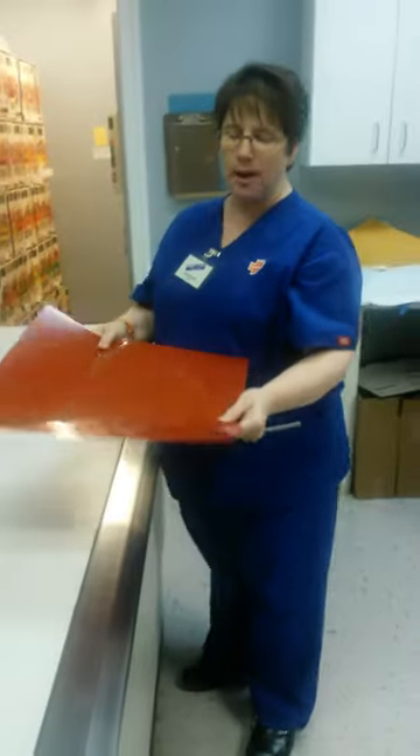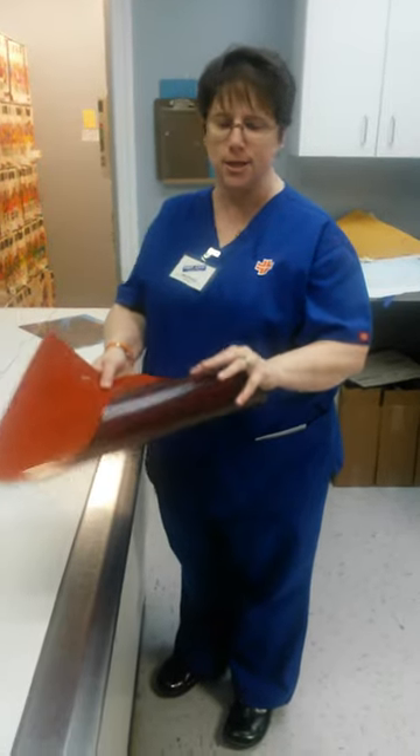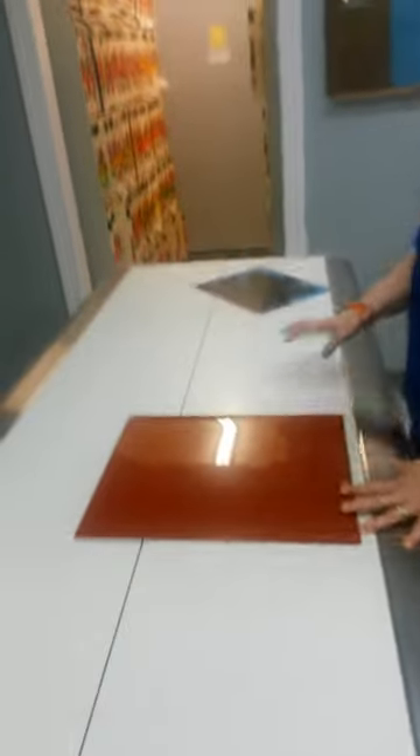This copy film has a light side and a dark side. If you hold them like this together, you can tell the difference. You want to lay the dark side down on the table, the light side facing up.